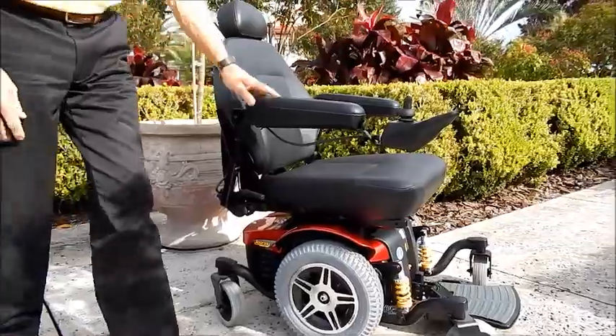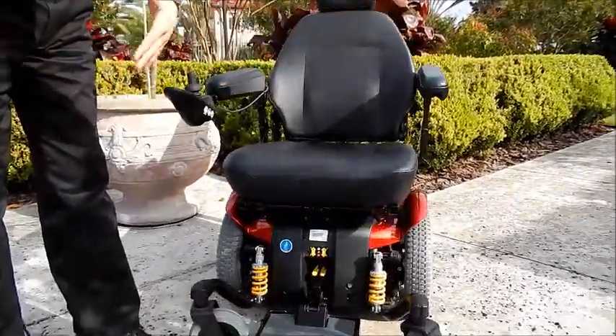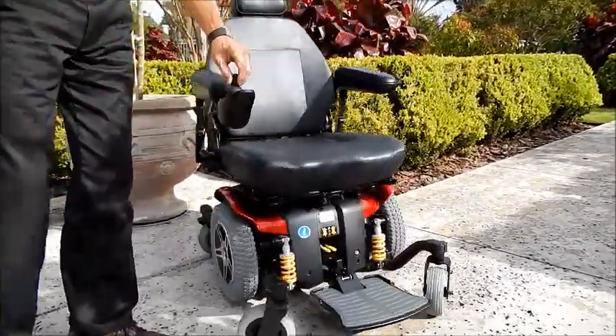This is a heavy-duty chair. The seat can be adjusted. We can make it larger or smaller depending on the person who's buying this chair.